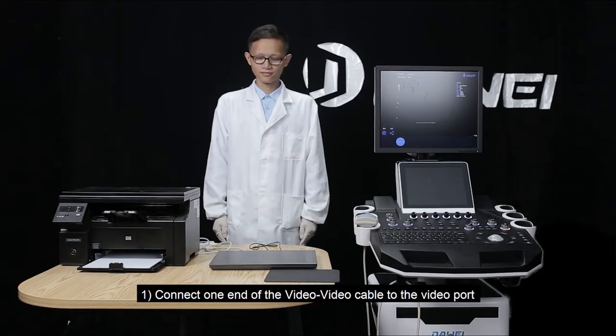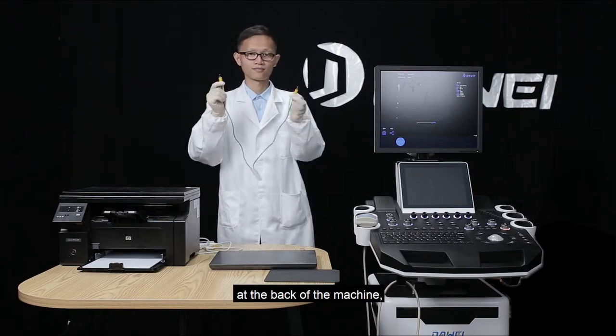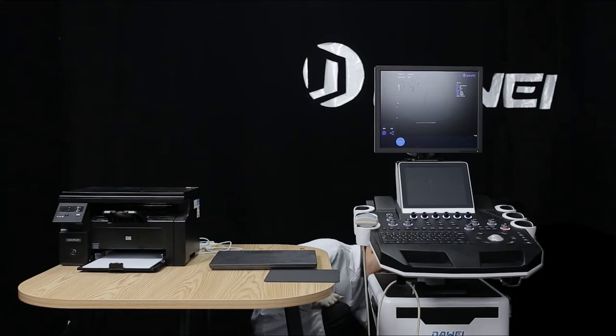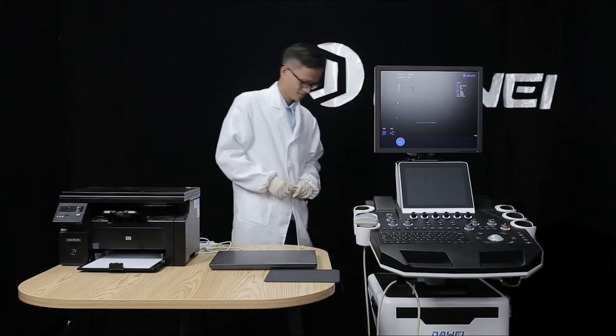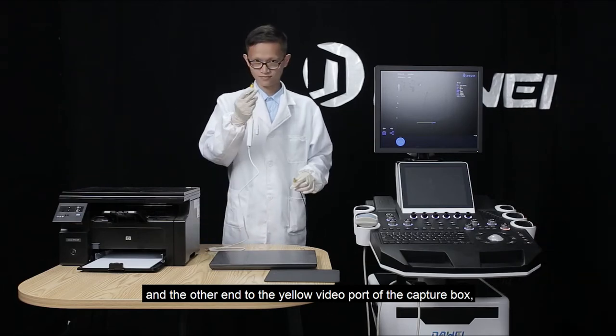Connect one end of the video-to-video cable to the video port at the back of the machine, and the other end to the yellow video port of the capture box.